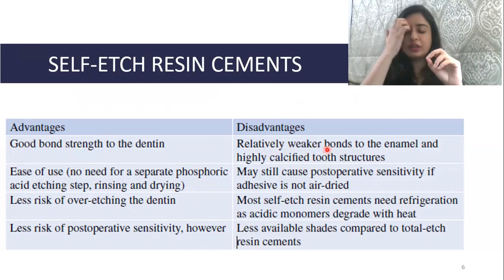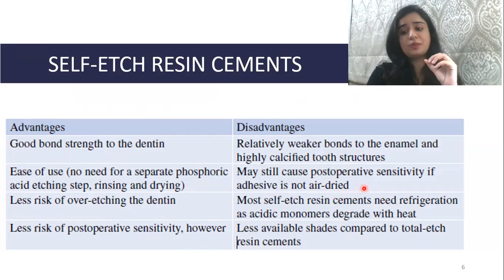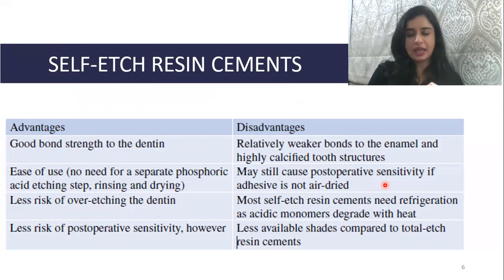And disadvantages will include relatively weaker bonds to the enamel and highly calcified tooth structures, because obviously total etch is the kind of bonding agent or the resin cement which gives the highest strength with enamel. It may still cause post-operative sensitivity if you have not used it properly, if the adhesive is not aired right. And one more important thing I would like to mention here is, please follow the manufacturer's instructions, whether you're using bonding agent or resin cements. If you're not going to follow them, it is going to lead to a failed restoration.